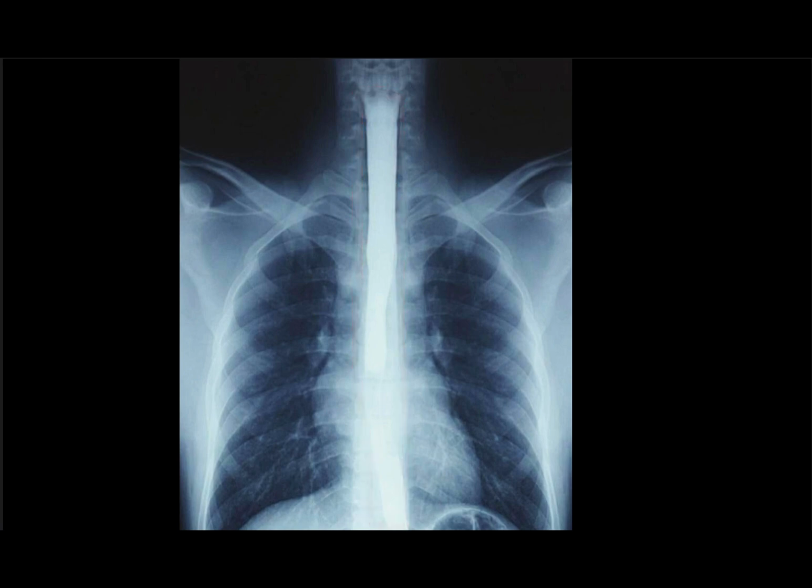A barium swallow is a very important procedure because it allows you to visualize the esophagus clearly on an X-ray, helping you to study the course, the shape, the lumen, and motility of the esophagus. And it can equally demonstrate abnormalities in the esophagus like narrowing or obstruction or abnormal dilatations.